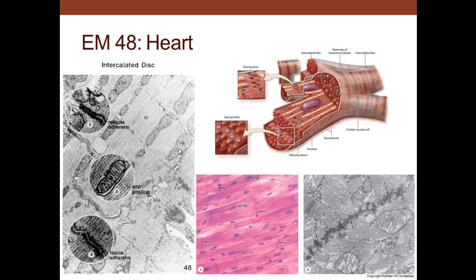In the heart, we can see junctions between adjacent cells. These are intercalated discs. Also, there's gap junctions between the two that can allow communication. You can see the intercalated disc in through there, and it's basically at the ends with the gap junctions on the sides.